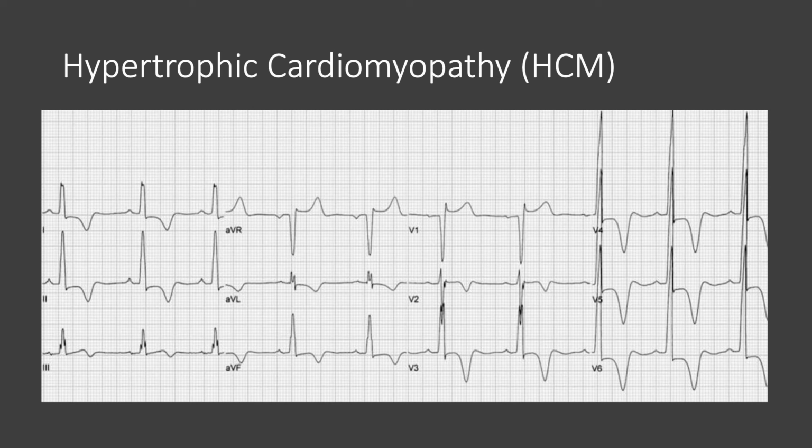You can see in this patient with hypertrophic cardiomyopathy that he meets the left ventricular hypertrophy criteria with a strain pattern, but he's missing prominent Q waves in the inferior and lateral leads, and he's also missing a left axis deviation. But he shows the classic deeply inverted T waves or giant negative T waves in his precordial leads. And these are characteristic of a patient with hypertrophic cardiomyopathy.